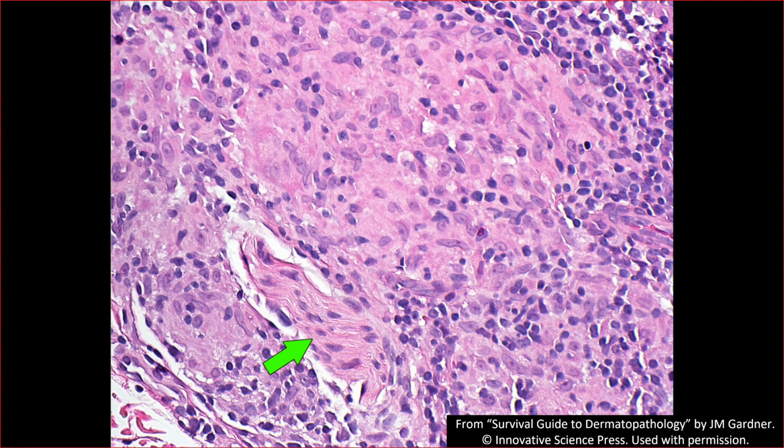I will point out that publications in the past few years, or maybe it's been a little longer than that, have shown that you can actually have perineural granulomas in sarcoidosis also. So this is not definitive for leprosy, but if I do a stain and I don't find organisms, I usually will send this for molecular testing to further exclude the possibility of leprosy. And in the end, if everything we've done doesn't find organisms, then I would recommend that the clinicians treat this like they would treat sarcoidosis, and obviously do additional clinical workup to see if the lungs are involved or whatever, but try to use immune suppressing drugs to see if the granulomas get better.